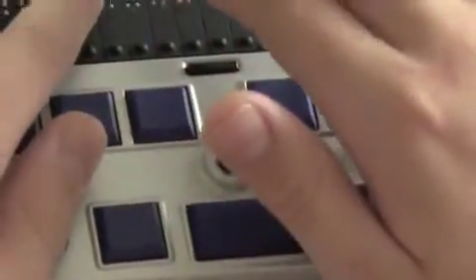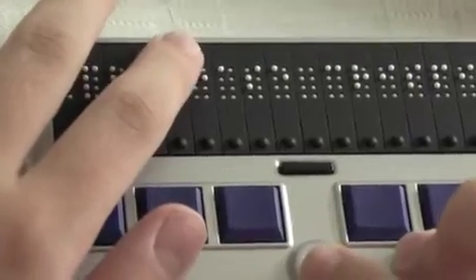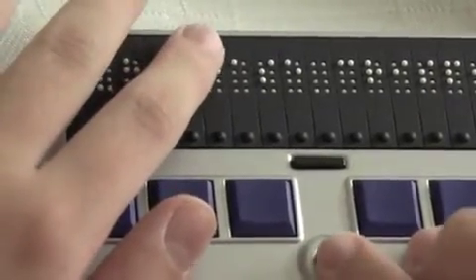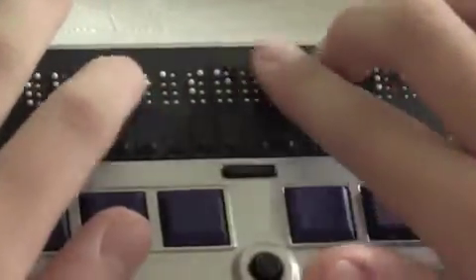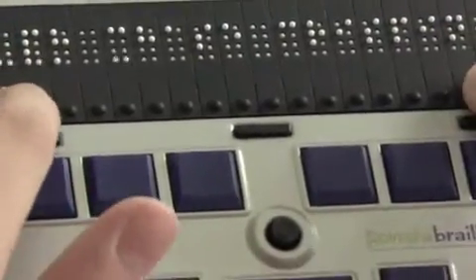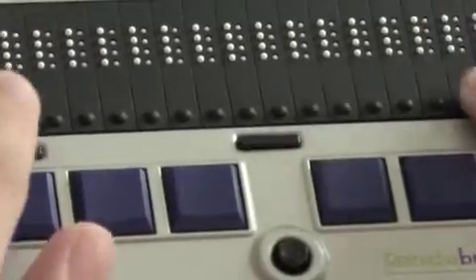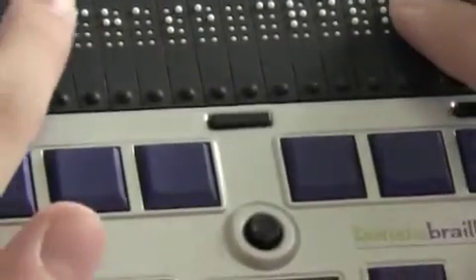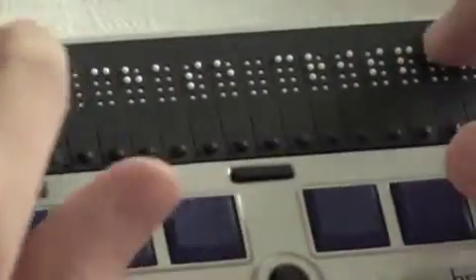To change the name of the Braille display, you press the cursor routing button under the cell you want to change and you see a blinking cursor. Use the joystick up or down to cycle through characters. When you're done changing all the cells you want, press the first two and the last two cursor routing buttons together, press again, and now it shows your new display name.